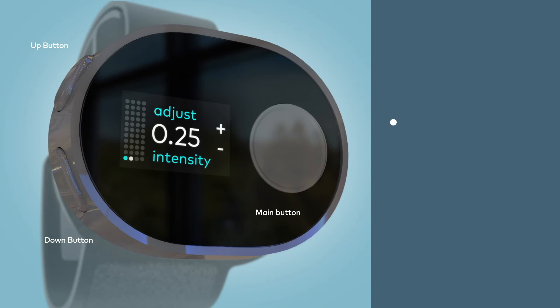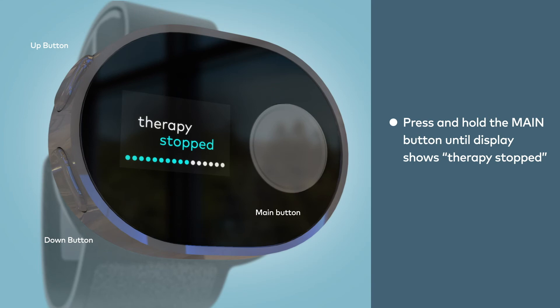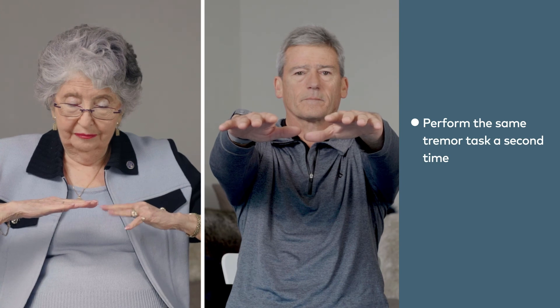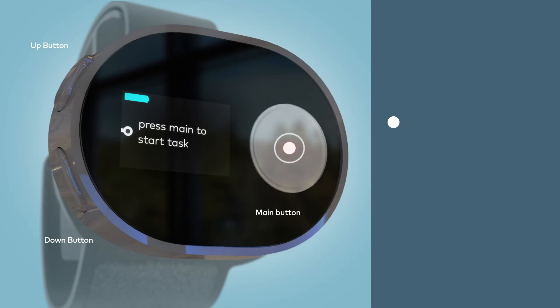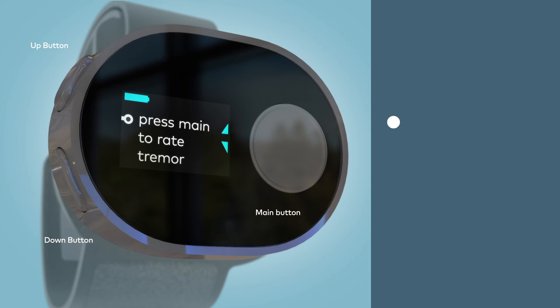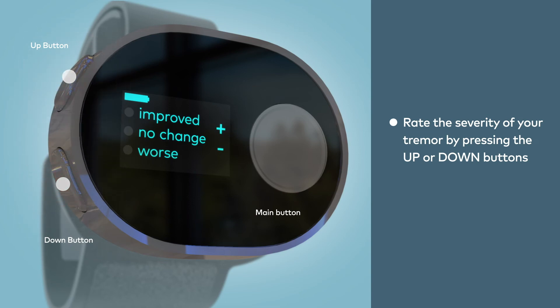You can always stop therapy by pressing and holding the main button until the display shows that therapy has stopped. After therapy has been completed or stopped, you will perform the same tremor task a second time. Assume your task position, press the main button, and hold until you feel the device vibrate. At this point, you will be prompted by the device to rate the severity of your tremor. Press the up or down buttons to share if you feel the tremor improved, had no change, or felt worse compared to before the session.